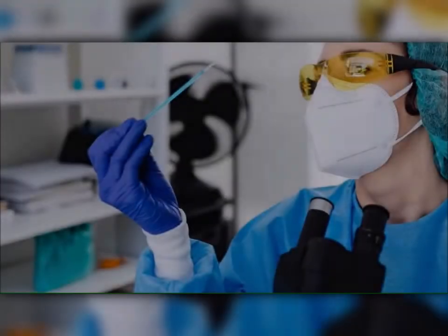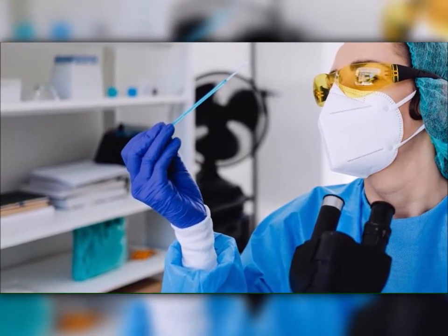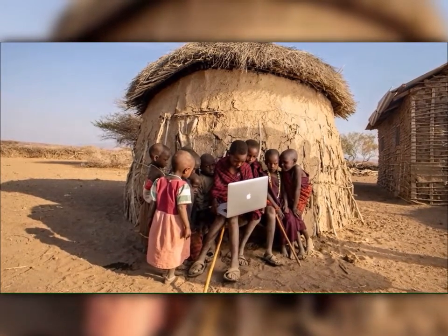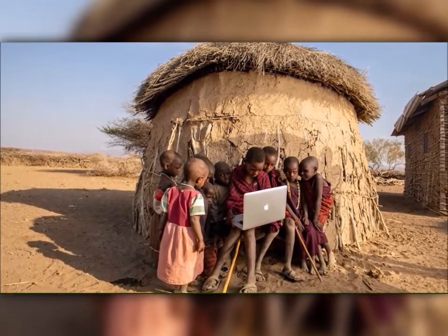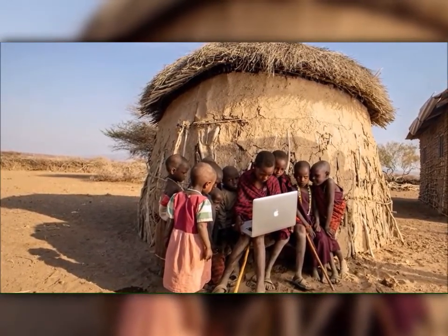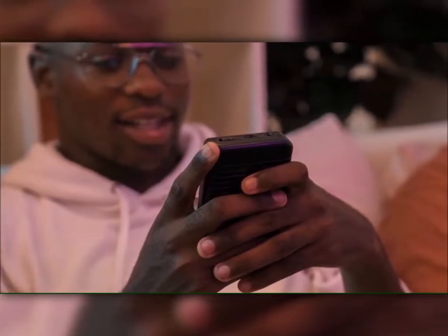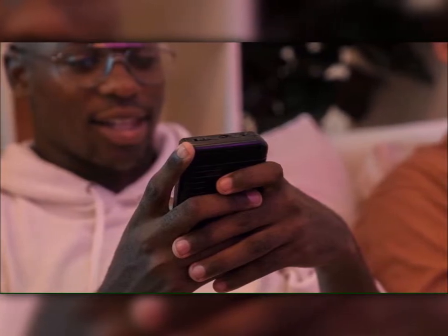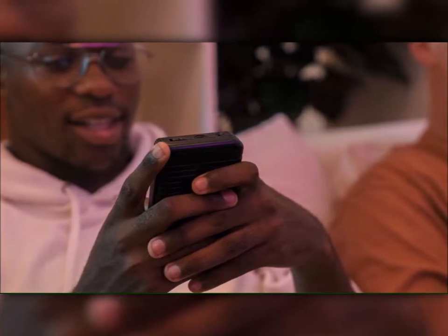We are optimizing this technique for rapid and affordable biodetection of an infectious disease. Our hope is to get something useful for low resources locations or harsh environments, and which device can adapt to those requirements. Of course, the mobile telephone adapts very well to a lateral flow immunoassay technique. We can take a picture of the test paper and use, for example, ImageJ for evaluation.